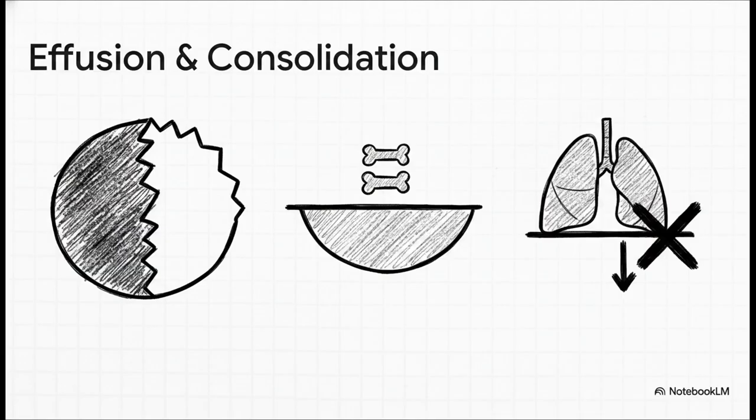Next is the spine sign. Normally, air in the lungs blocks you from seeing the spine above the diaphragm. But if pleural fluid builds up, that fluid transmits sound perfectly, and suddenly the spine becomes clearly visible above the diaphragm. Lastly, the curtain sign. A healthy lung moves over the diaphragm like a closing curtain. If that dynamic sweeping curtain motion is disrupted, you are definitely looking at pathology.